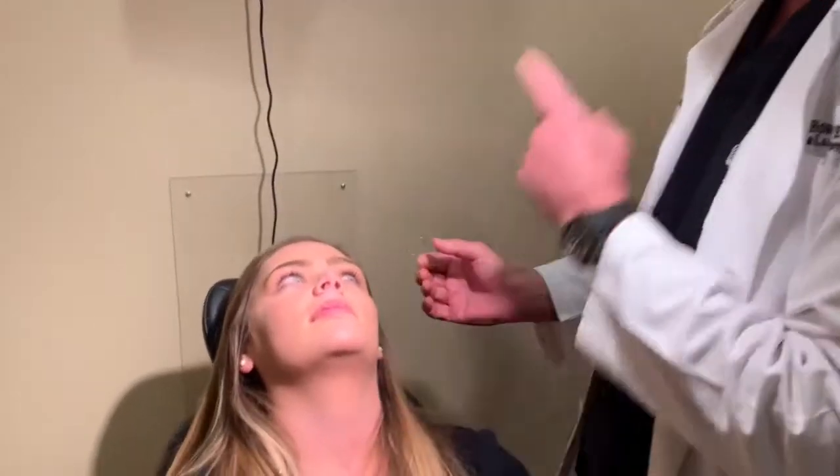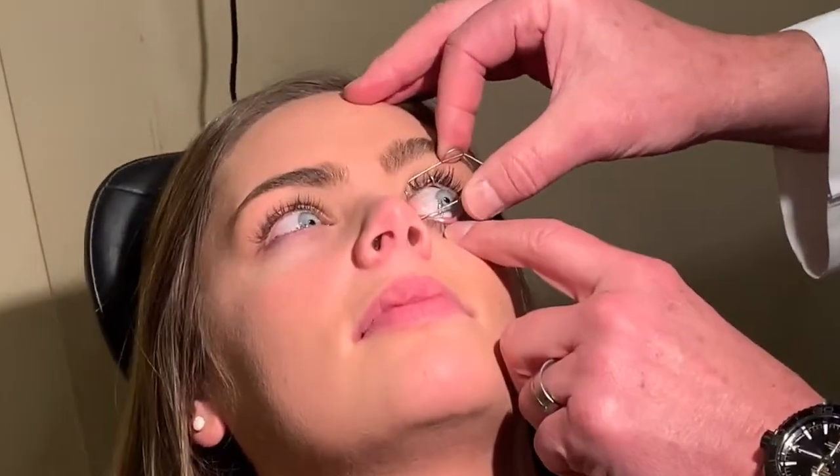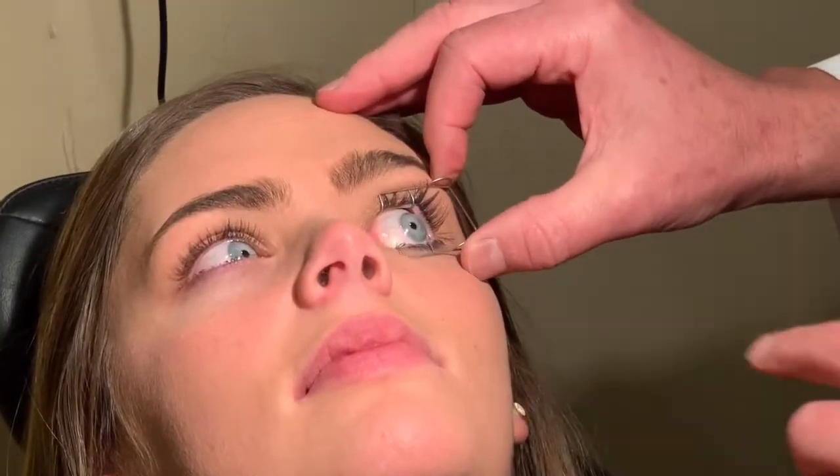We'll come a little bit closer here. Brooklyn, why don't you look over at me — just watch my nose. I always put it in to the nasal side, and then center to center. Keep looking straight up, and that's as simple as that.